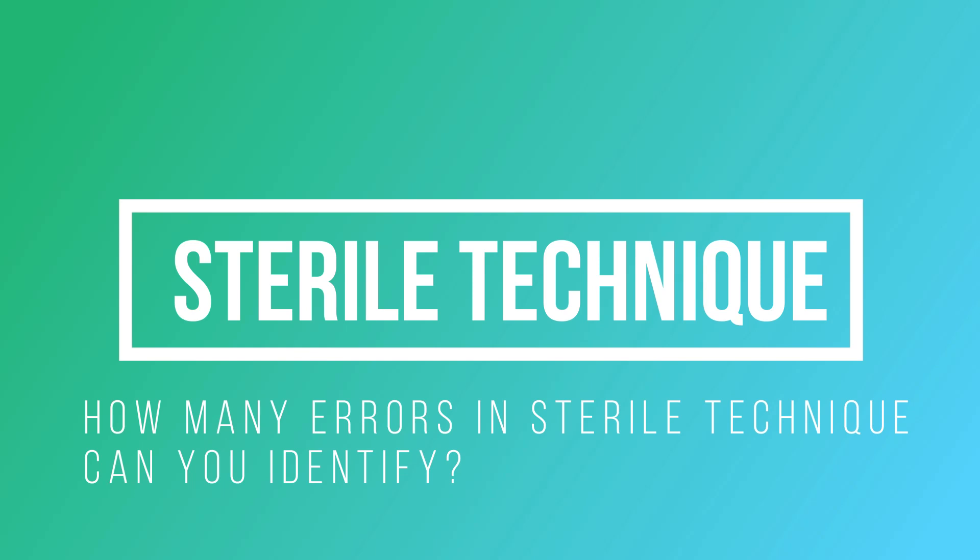How good are you at spotting errors in sterile technique? Let's test your skills. Watch this video of a sterile procedure and write down all of the errors that you find. Let's see if you can find them all.